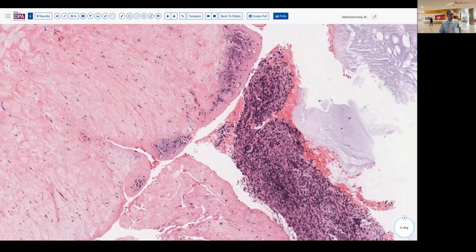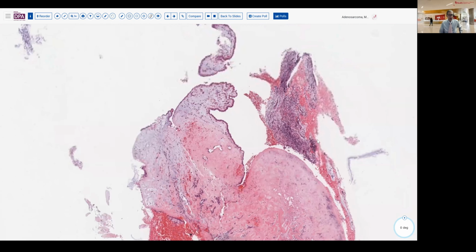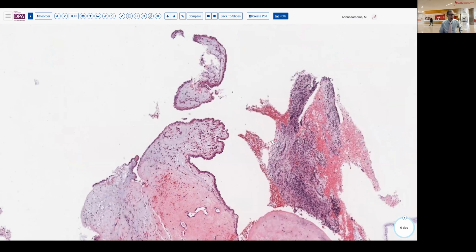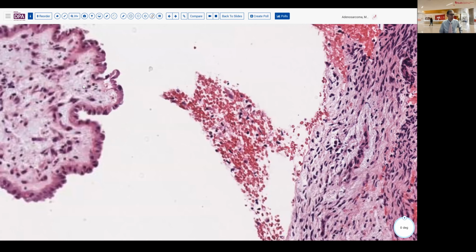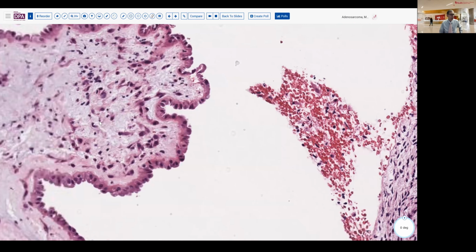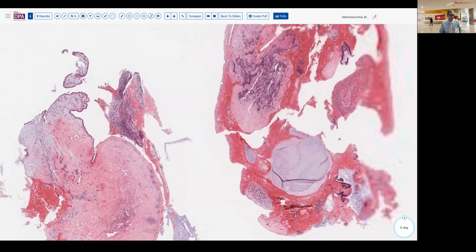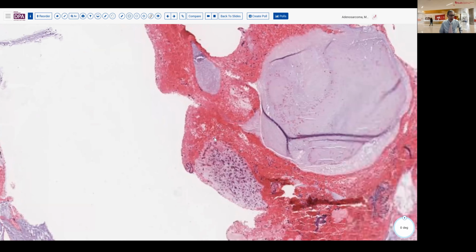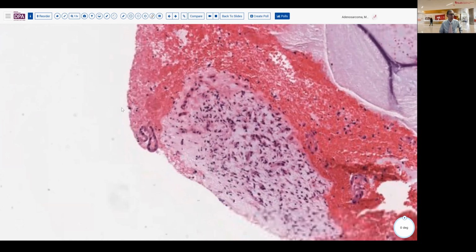And let's see if we can come here a little bit more. Up in here, I think we begin to see a little bit greater degree of some degree of atypia in this stroma. Particularly here, where there's just a little bit of variability in the stromal tissues. So it's not very convincing at this point, but because there were several of these kinds of areas on the other slides as well, we were struck that this presented a learning opportunity.